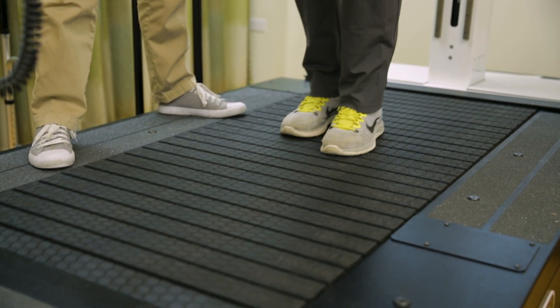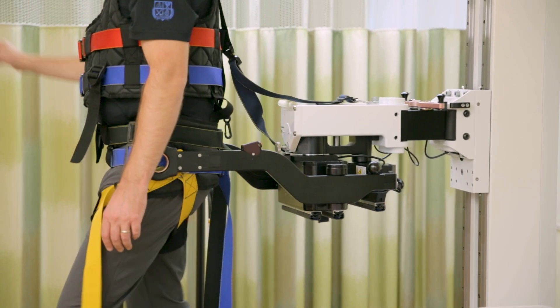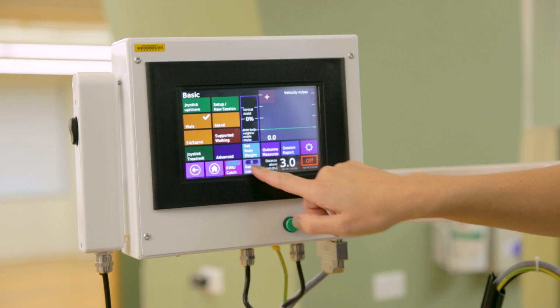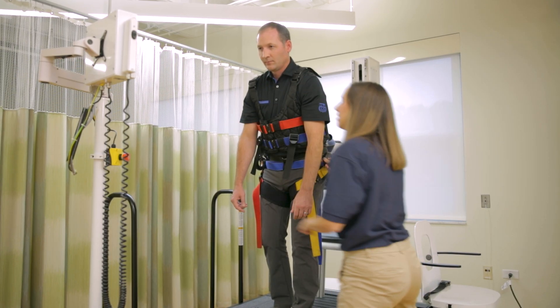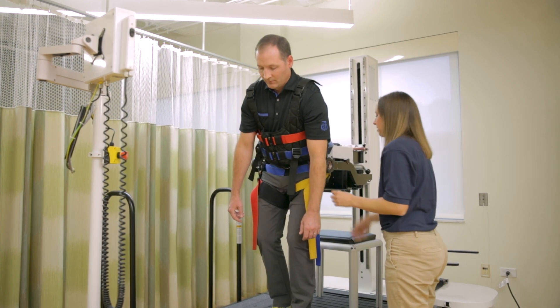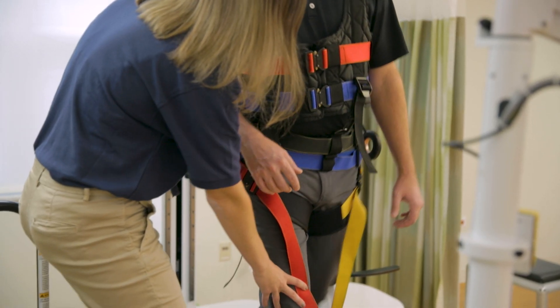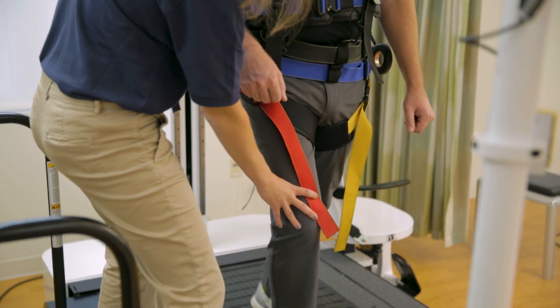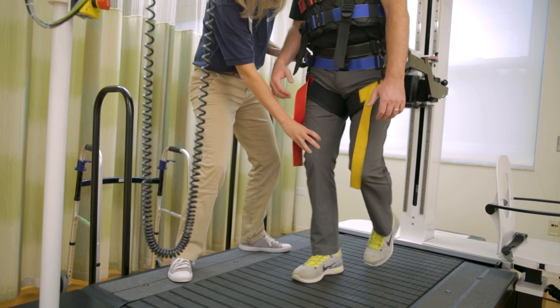The treadmill and mechanics of the system are activated and driven solely by you, and your therapist can override the treadmill speed and operation as needed. The KineAssist MX allows you to try different balance-related tasks without fear of injury. It also offers safe retraining of skills related to real-world obstacles, such as slipping or being bumped in a crowd of people, which may result in feeling off-balance.